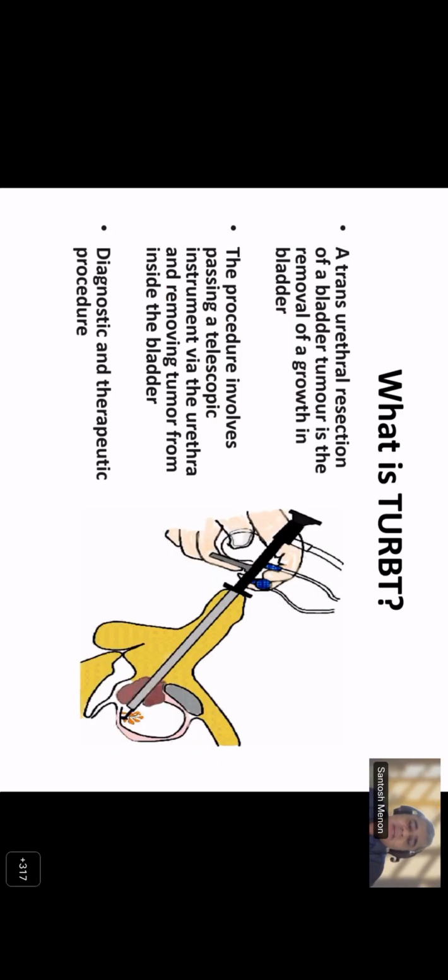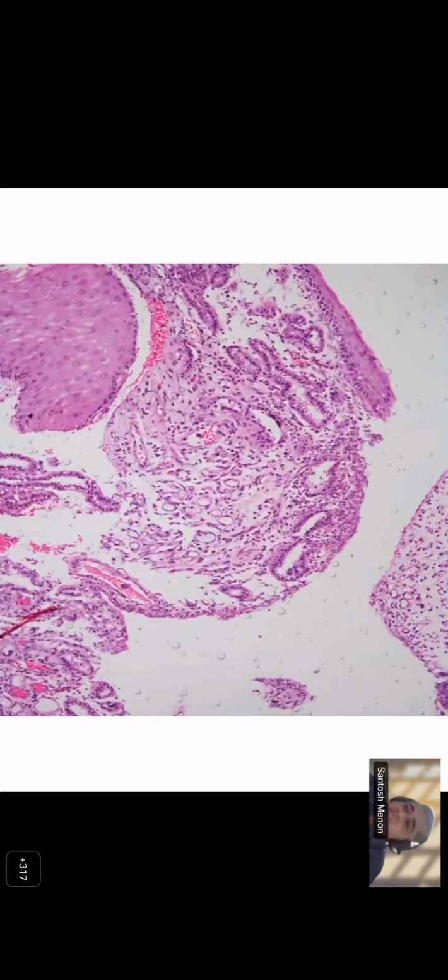And what we had was only slides. We didn't have other findings in detail. If somebody can show what is going on here, maybe Parul can start with this. Yeah, sure, sir. In this case, there is a lining of stratified squamous epithelium. Let's discuss this slide first. What do you see on the screen?